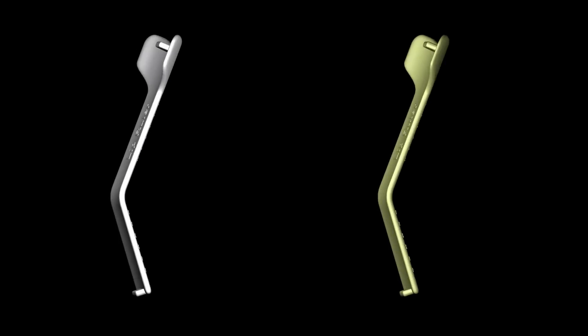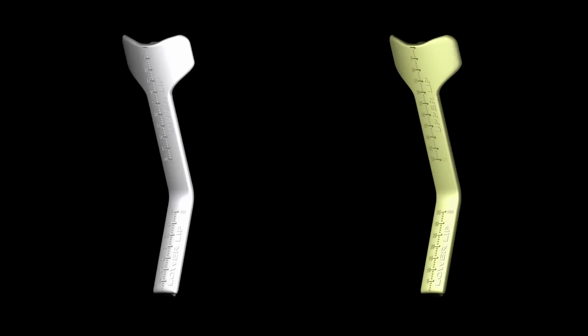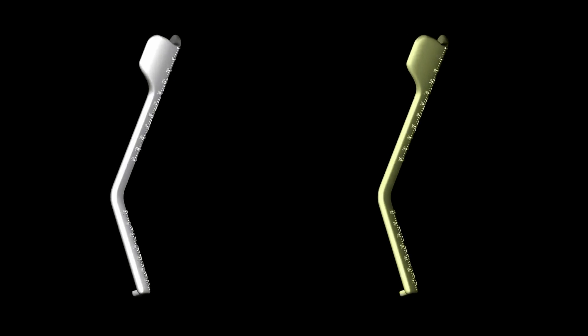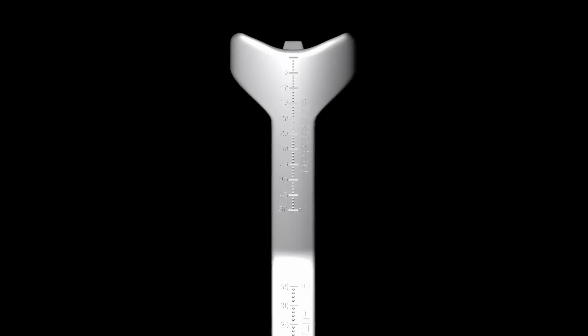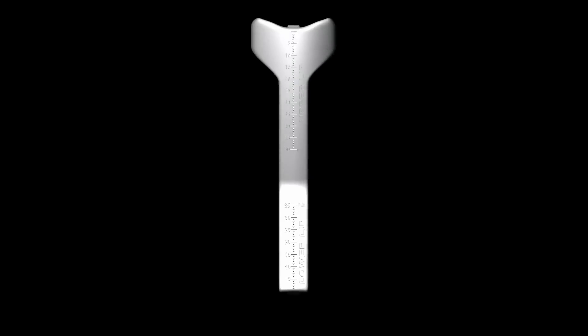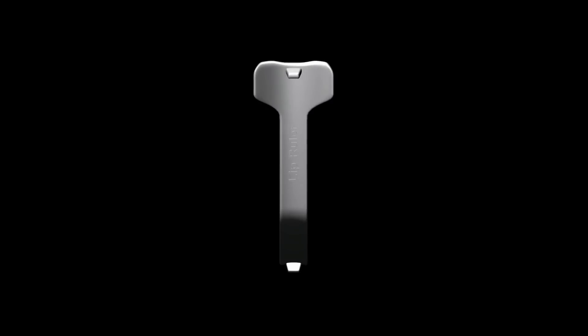The lip ruler is available in both white and yellow colors, with white recommended for the dental practitioner and yellow for the laboratory technician. On the aesthetic lip ruler, there are both maxillary and mandibular millimeter gauges to facilitate recording. Note there is a horizontal projection on the upper and lower back half of the ruler. This projection acts as a rest on the pre-maxillary ridge crest and the pre-mandibular ridge crest to secure the ruler during measurement.